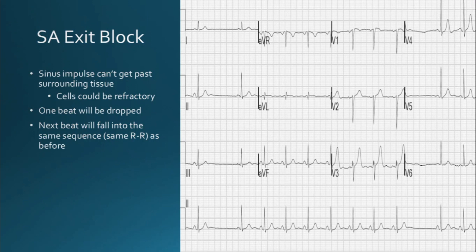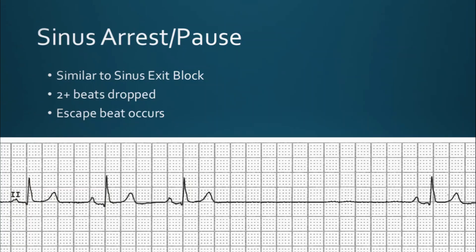We can see an example of this below. You can see the R-to-R interval is the same, so let's march this out. You can see here is where the other QRS was supposed to be, but it was blocked. The next QRS that occurs is in line with the rest of the rhythm. The heart was able to overcome the refractory cells and restart in the same sequence, so the R-to-R interval remains the same.